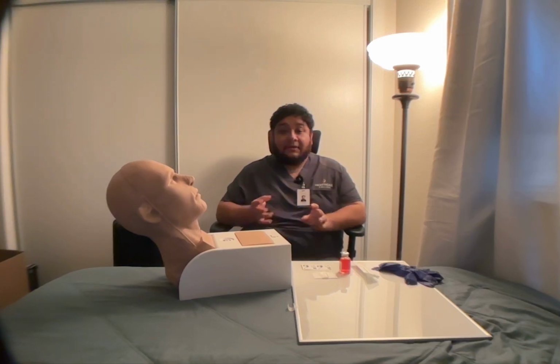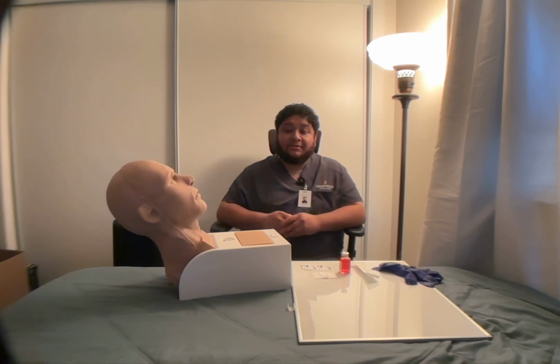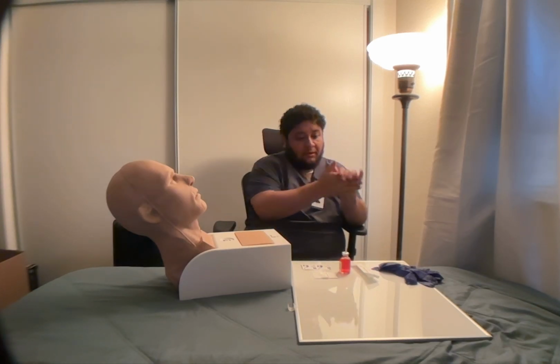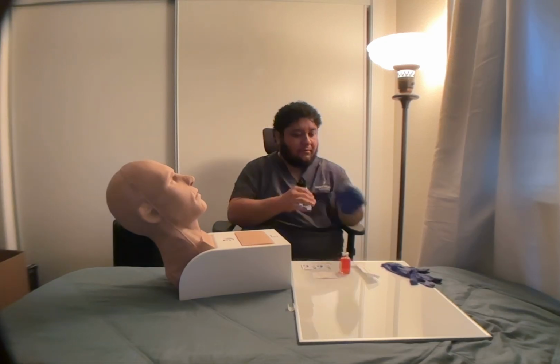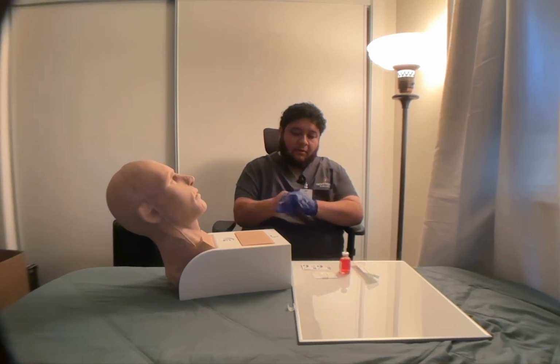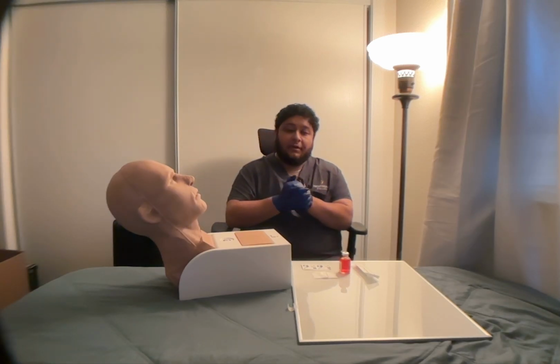Mr. John, this is going to be my 2 identifiers too. Mr. John, do you have any allergies by any chance to medication, food, or any environmental allergies? Patient states no allergies, so nothing to worry about there. Okay, now I'm going to perform hand hygiene, and I will apply my gloves. Gloves are on.